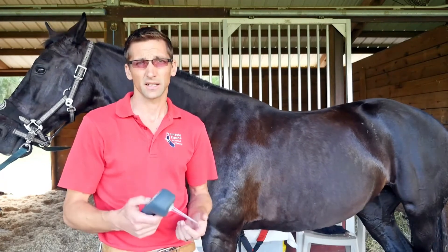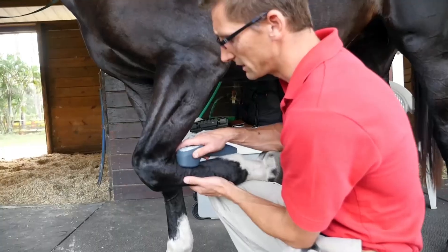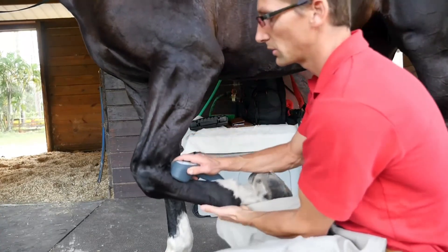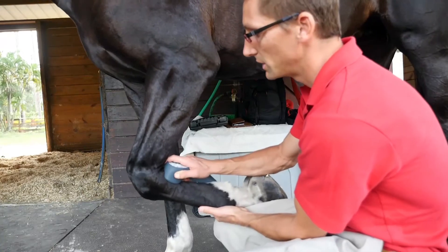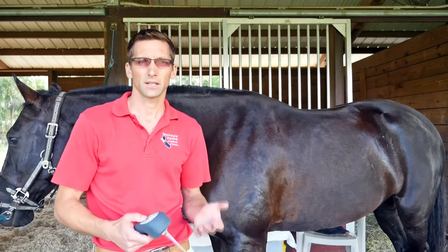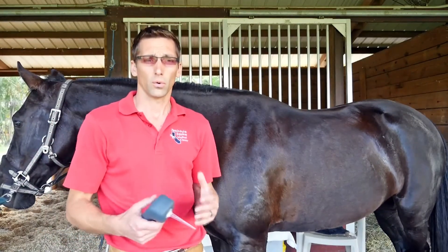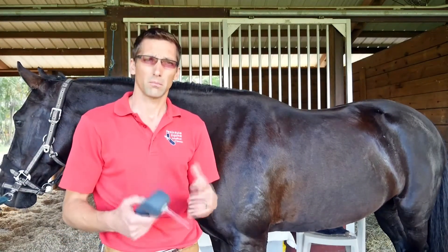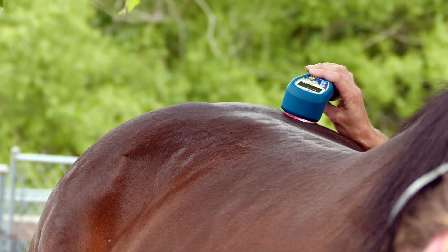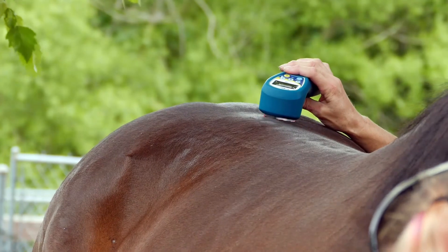The other aspect I like is that it's very portable and user-friendly, ideal to take within your vehicle and use in an ambulatory practice — on the spot while treating patients and in combination with other modalities. I use the laser the most for horses with a lot of myofascial pain, back pain, and muscle trigger points, and I use it in combination with acupuncture a lot.